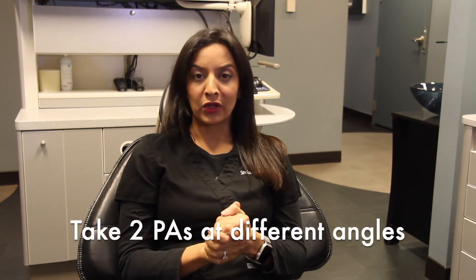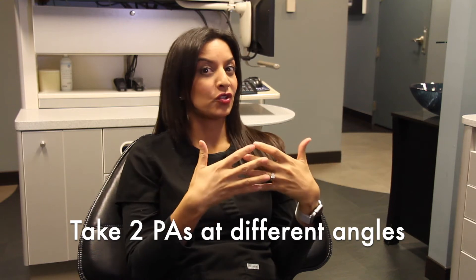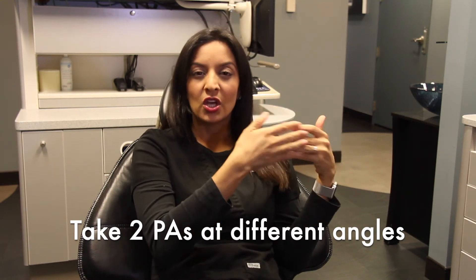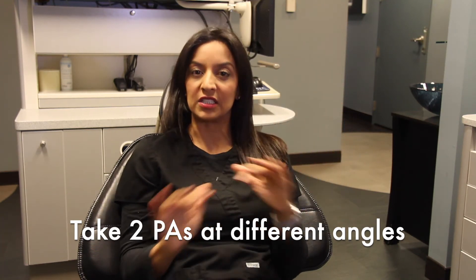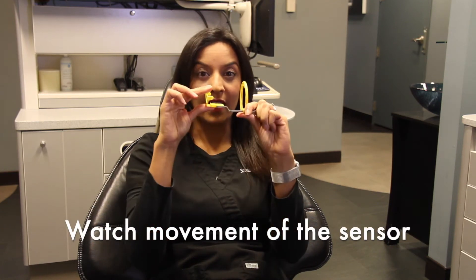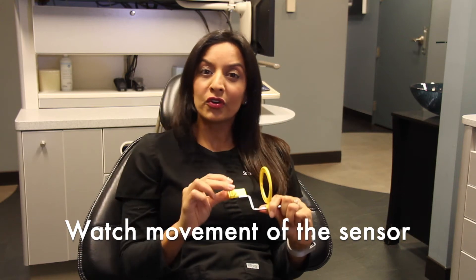To wrap that up: make sure you take two periapical radiographs. You want to make sure that you're changing the angulation of that tube head pretty drastically — not just a small change. Make sure you have strong movement so you get two definitely different angles. Also keep an eye on the flexion of the sensor because that could change your vertical angulation and prevent you from seeing the pulp chamber.